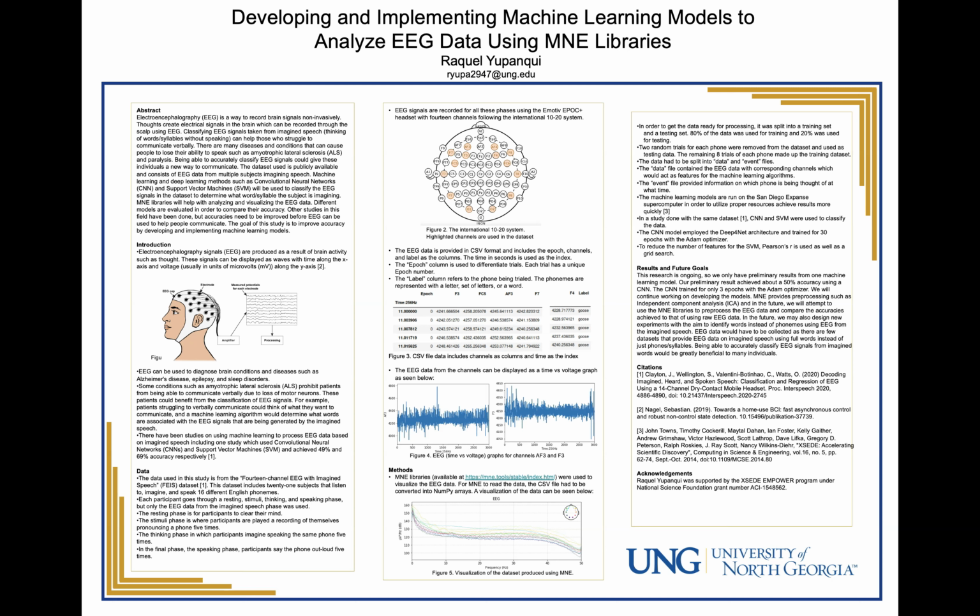In the future, we will use MNE for pre-processing as well. MNE includes independent component analysis. We could compare results achieved with the raw data versus the pre-processed data. In the future, we may also attempt to classify words as opposed to just phonemes. This would be very beneficial to our overall goal of helping people communicate.